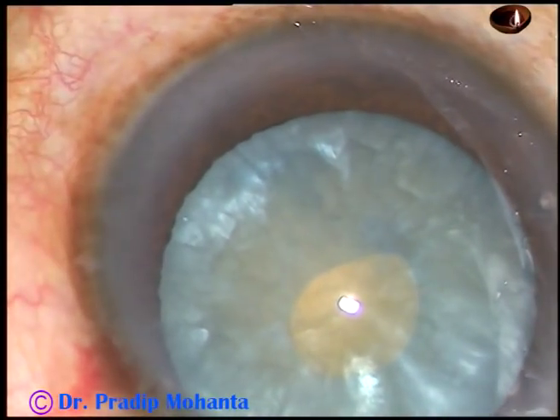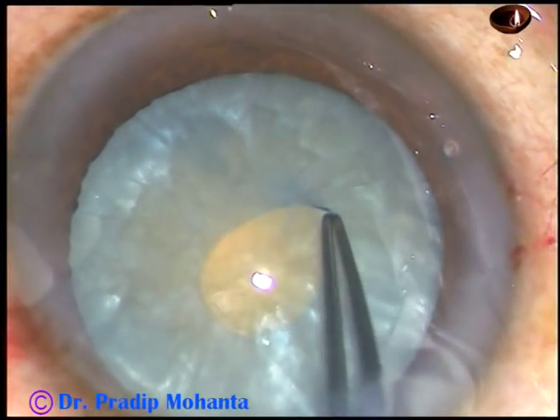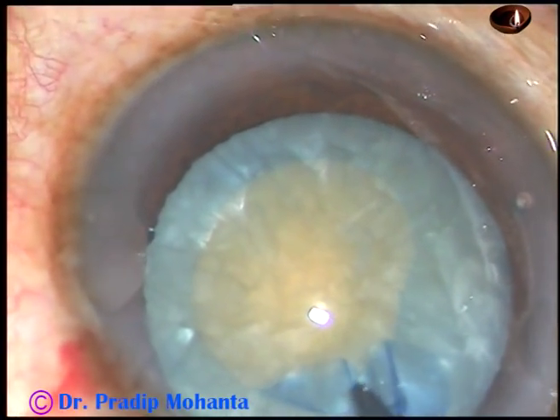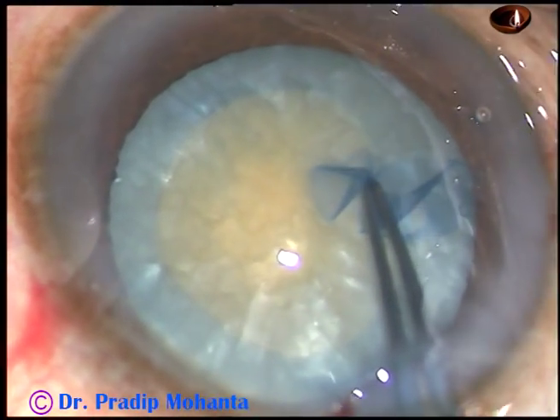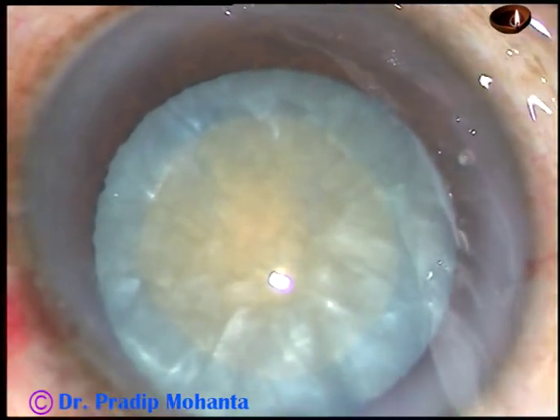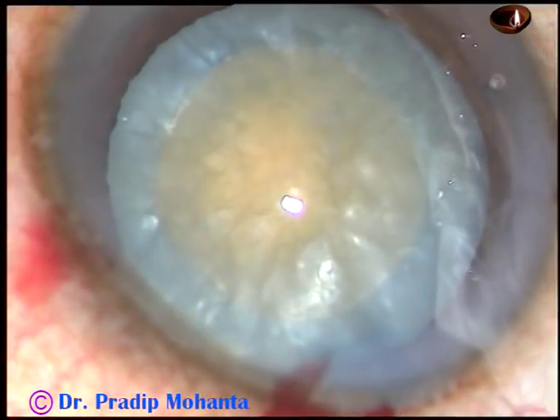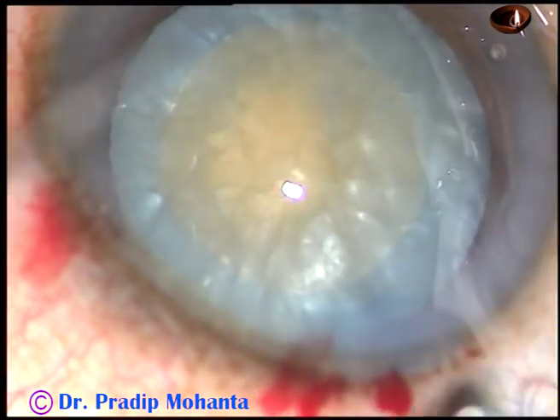I find it comfortable at 8 o'clock because my incision is in the supero-temporal aspect. Now I enlarge this mini rhexis into an adequately sized rhexis with the help of utrata forceps. So the main challenge of this intumescent cataract is over. We have done a beautiful rhexis — adequate sized, about 5 millimeters or 5.25 millimeters.